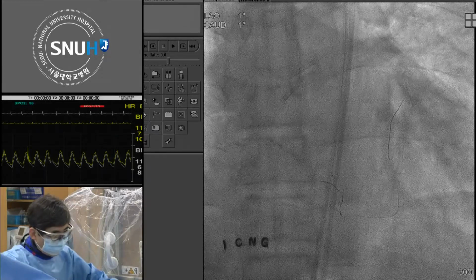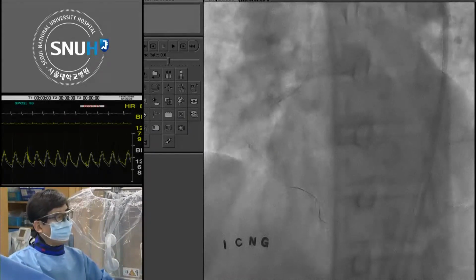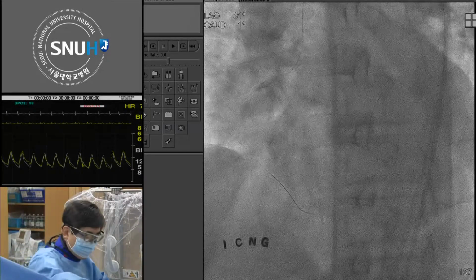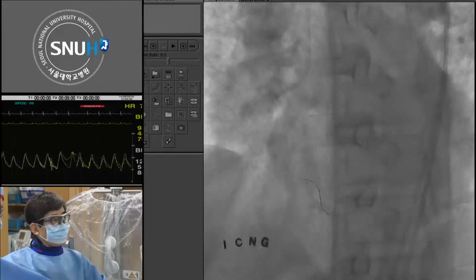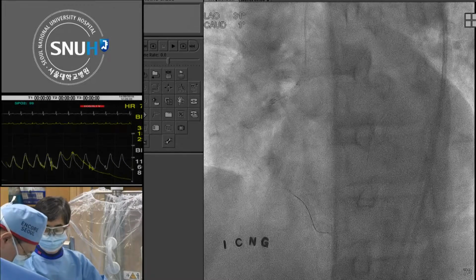Professor Kim, we have 5 minutes left. What I'd like to show you is just passing the microcatheter. After that, please explain your further plan. For the plan, I just deliver the whole process to Dr. Igarashi.